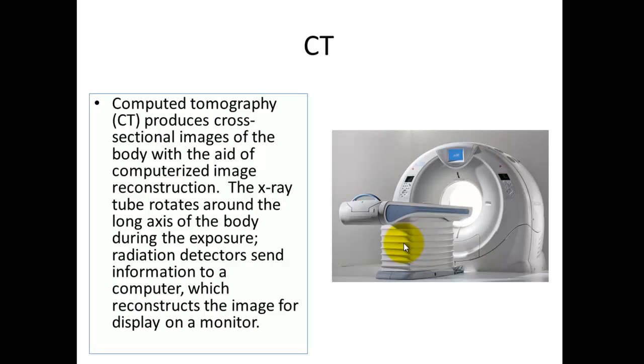Now let's move on to a modern computer tomography unit. We are still talking about sectional images, so cuts of the body. And basically, when you compare a 14 by 17 KUB radiograph, think about this. You have 17 inches of open collimation. And we all know that if you increase your collimation, make your field size larger, you will get more scatter.